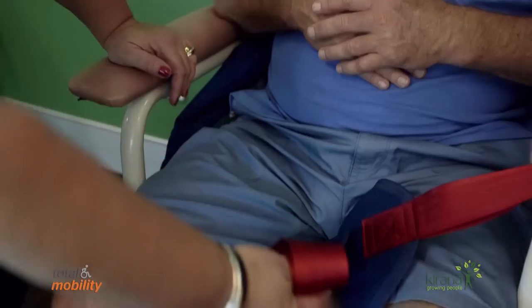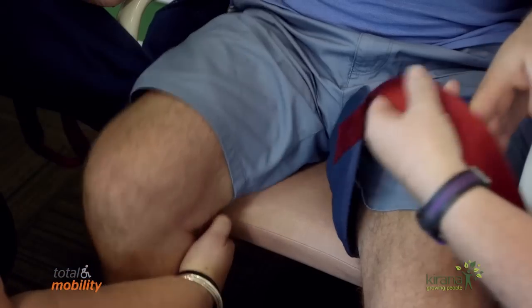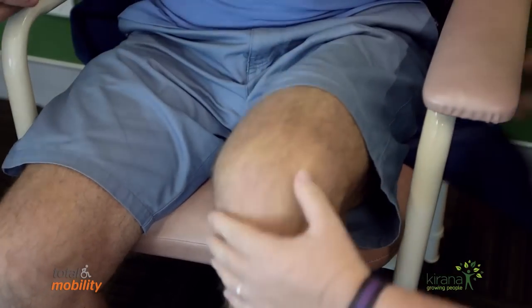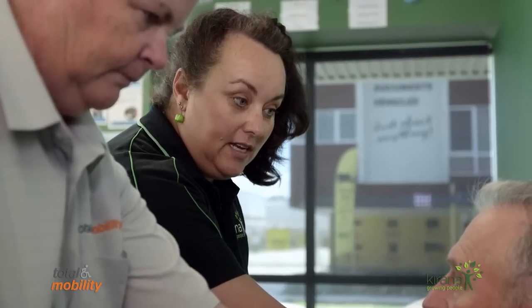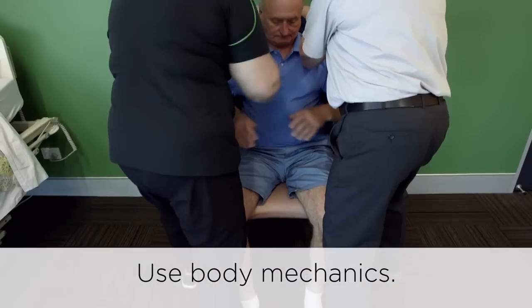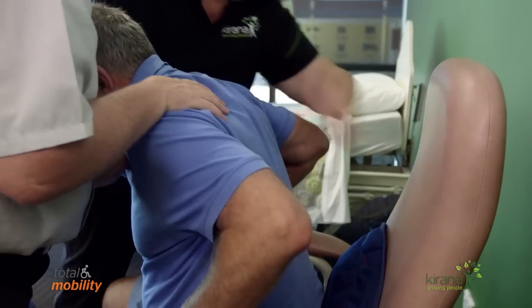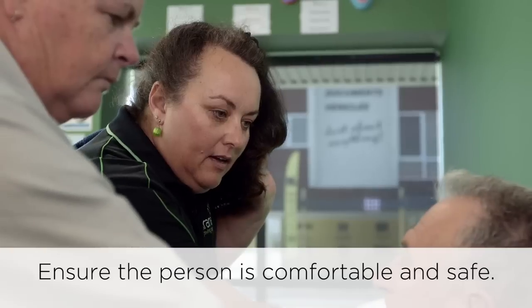So first we're going to kneel down. If you're able to gently lift your leg, we're going to fold this strap and very gently slide it out from underneath your leg, and do the same on this side. Now Mr. Williams, Angela and I are going to place our feet in front of your feet, placing one hand in front of your shoulder — we are not using an underarm hook — our other hand is going behind your shoulder. If you could place your hands on the side of your chair and help us with this manoeuvre, that would be good. So we'll count to three and say forward — one, two, three, forward. Well done. And now we're going to remove the sling from your back — one, two, three, back. Well done Mr. Williams.